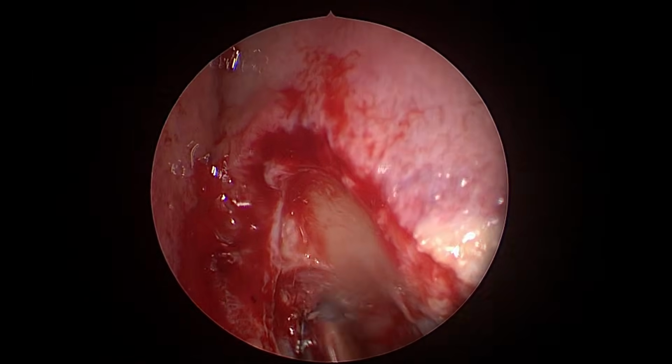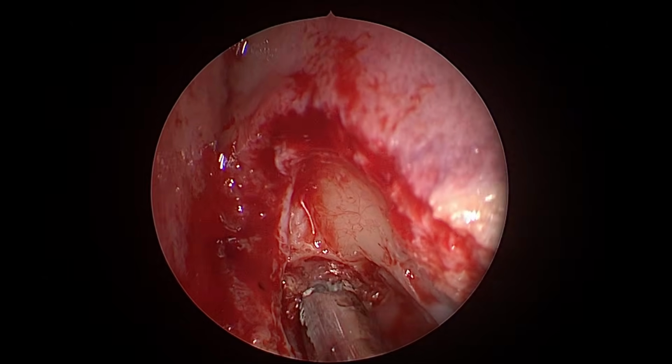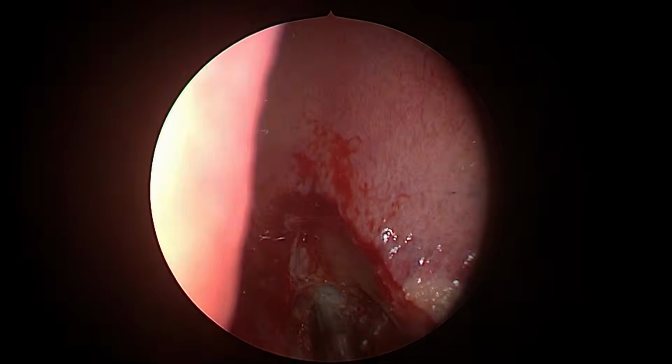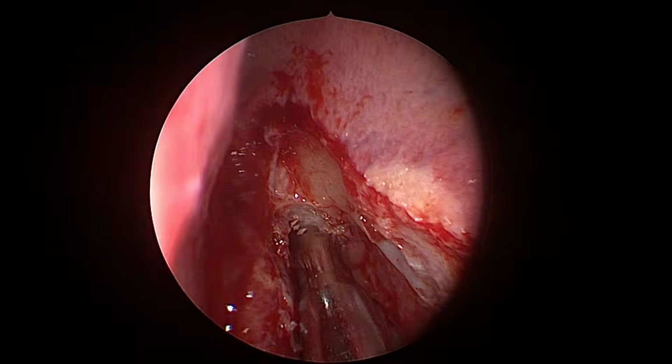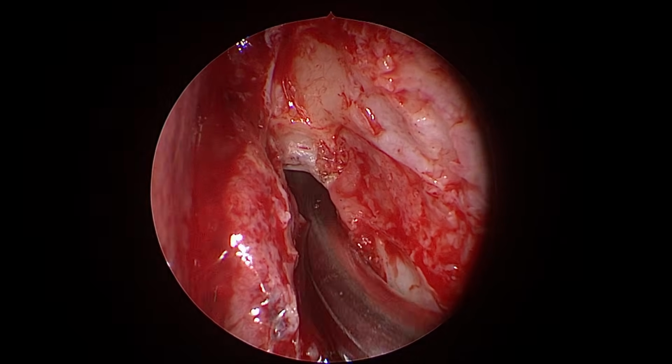See, in front of everybody, under vision, see my beak? Yes, sir. I am following the beak, following the beak. Follow this beak. Where the beak ends is my frontal sinus.